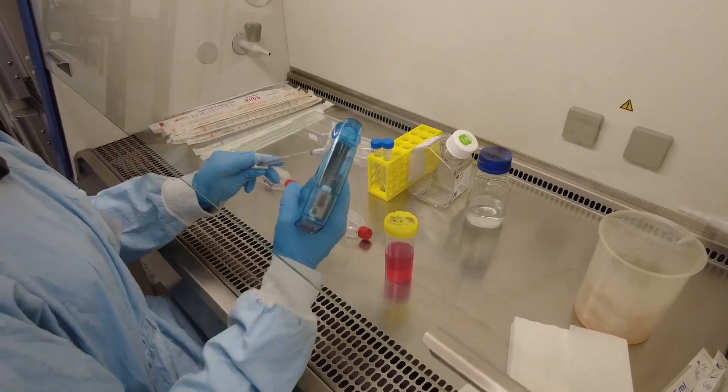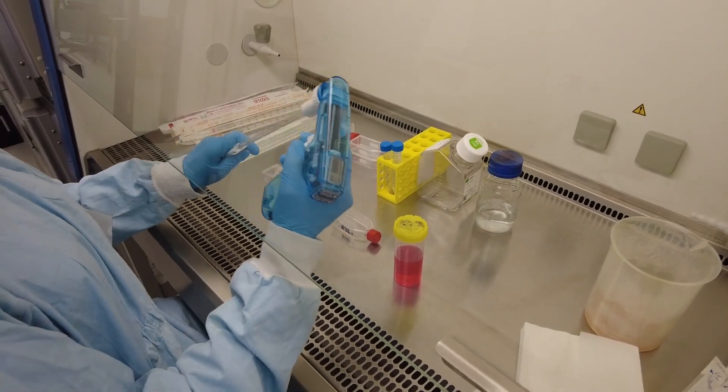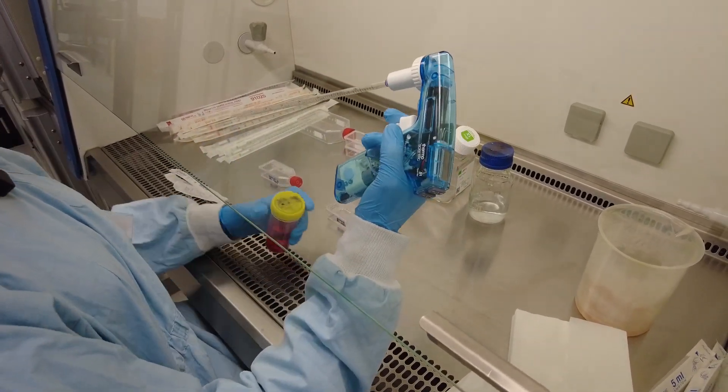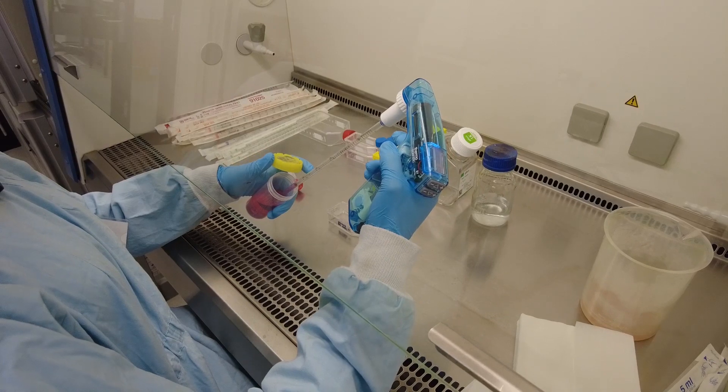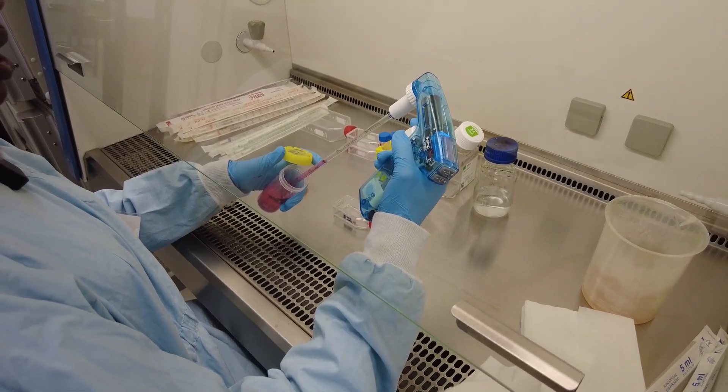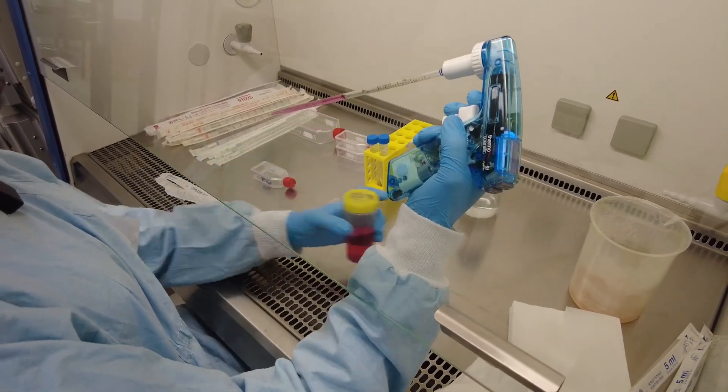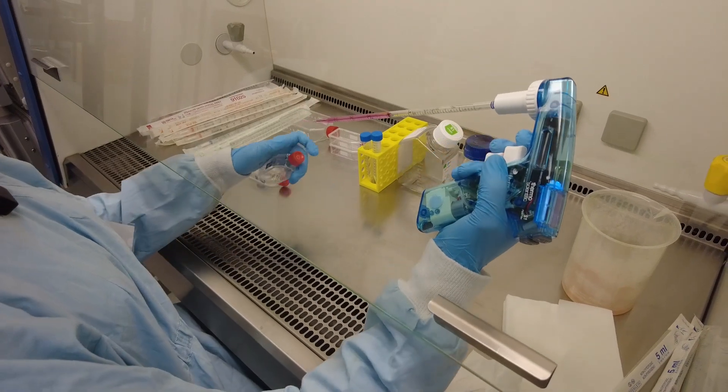So now we're going to add media to neutralize the reaction of lifting of the cells with trypsin. We're going to add two ml into each flask, same volume as trypsin that we added. This will neutralize the reaction.